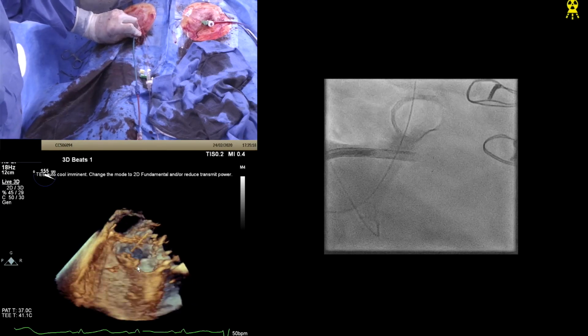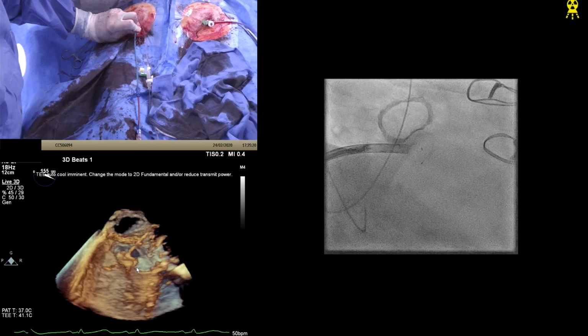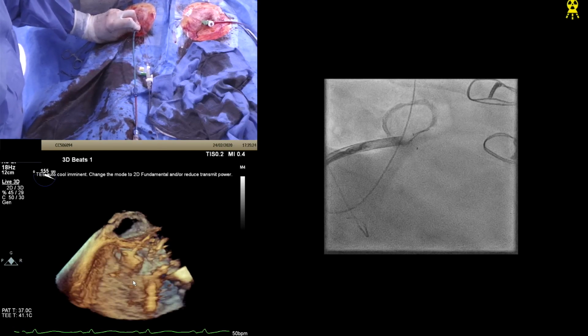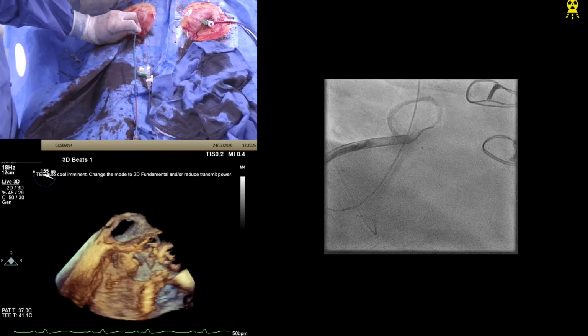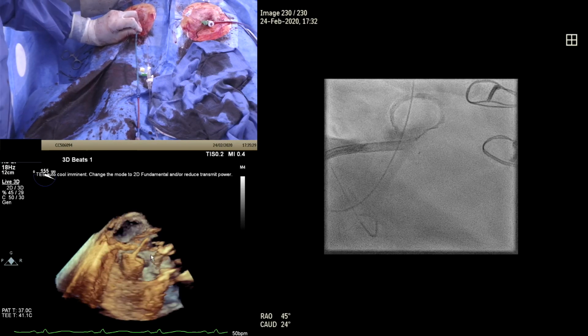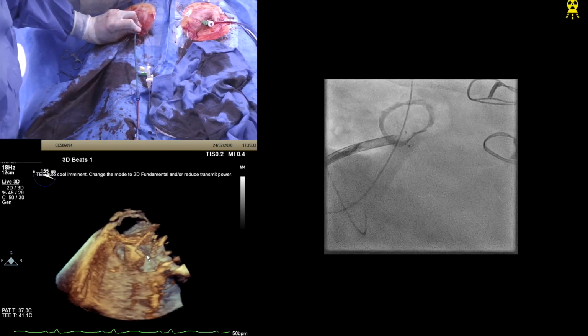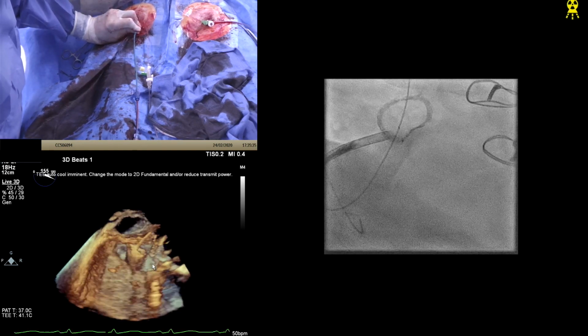Okay, so now we've got the disc. I'm going to bring the disc down. Be brave. That's it. You freed it now. Okay, so how's that doing? So it's looking good. I think when you get closer, you'll maybe need a slight rotation, but you might be okay.